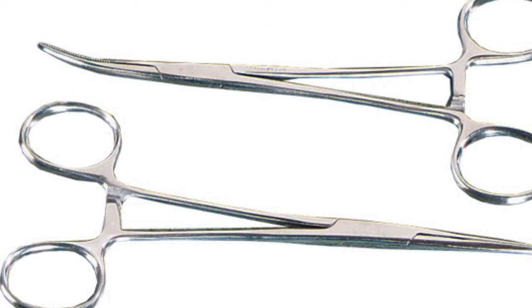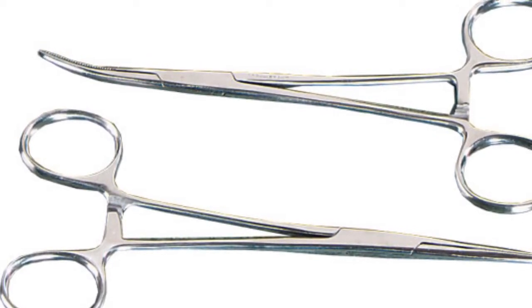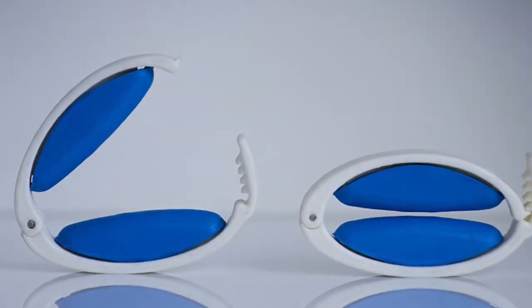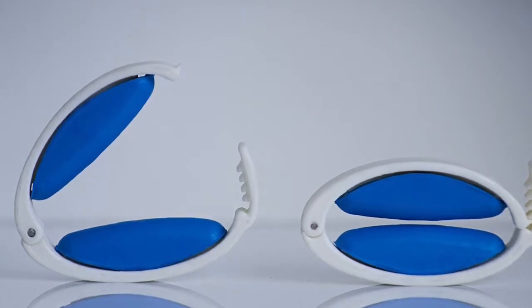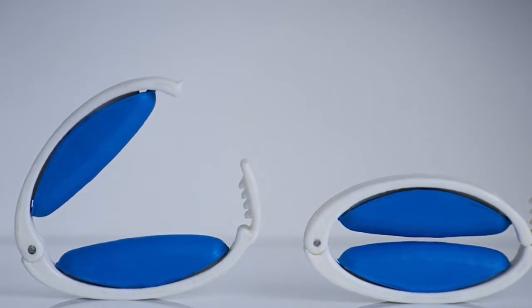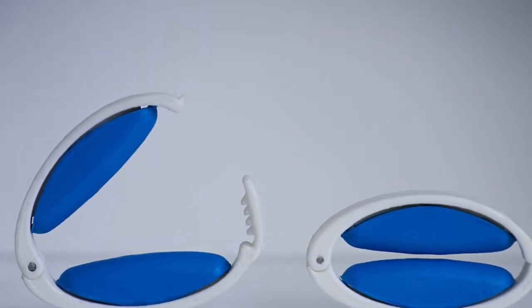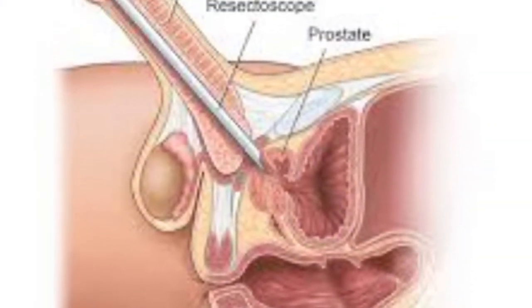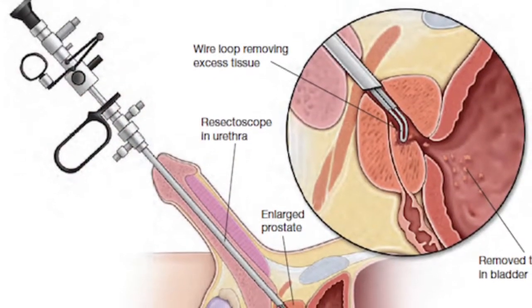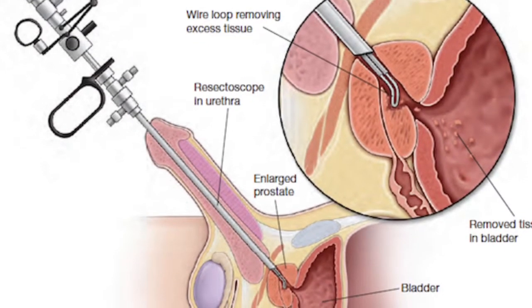The instrumentation needed for this would be a sterile screen, a rigid fiber optic cystoscope, a resectoscope, a bridge required for the telescope to fit into the sheath, a stopcock, hemostats, and catheter nipples, and a penile clamp. During this procedure, continuous irrigation is used to maintain a clear view and to evacuate small pieces of tissue.